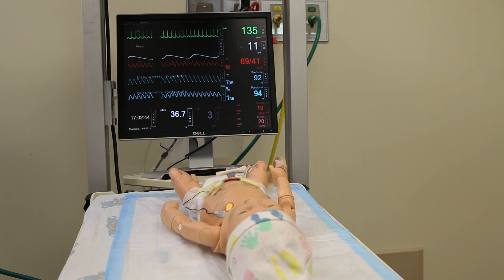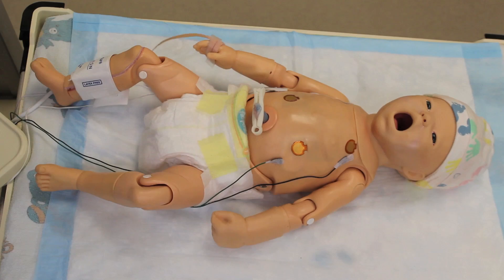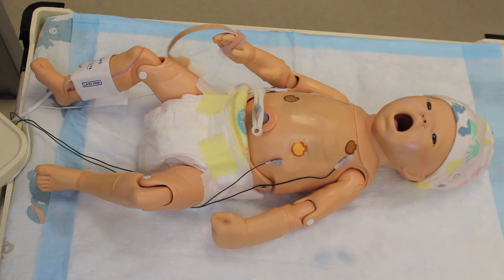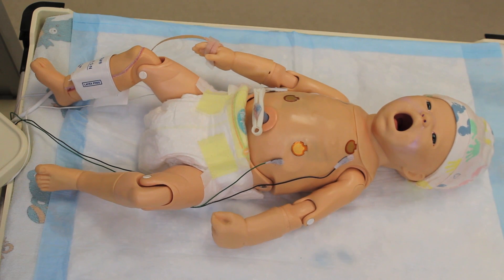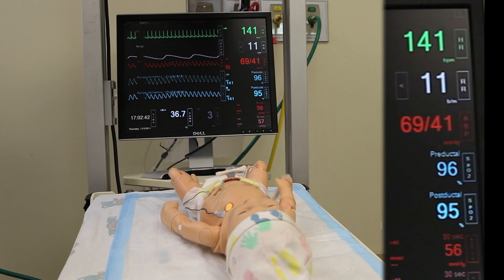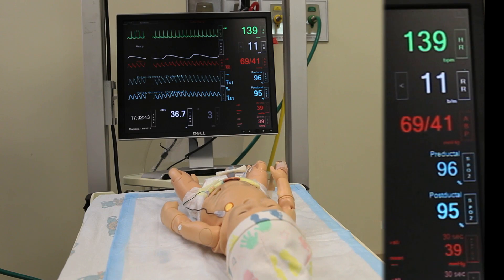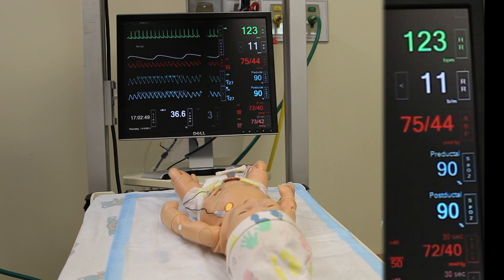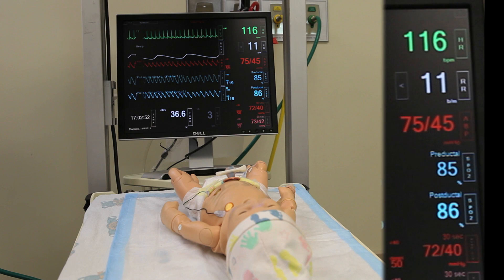The movement we see now represents seizures. In the STABLE scenarios, the baby is programmed to have physiologic correlation when he has a seizure. Take a look at the monitor. During a seizure, the baby's heart rate is going to go down, his saturation is going to drop, and his blood pressure is going to go up.